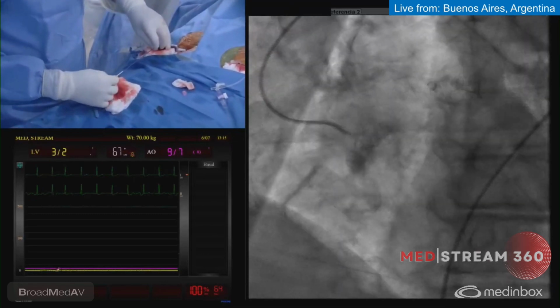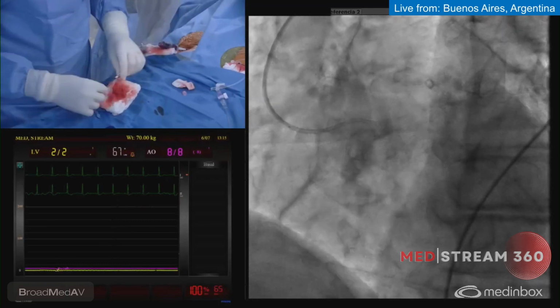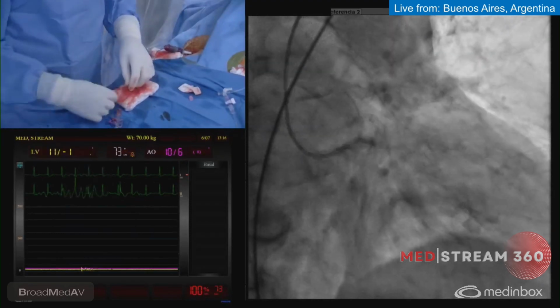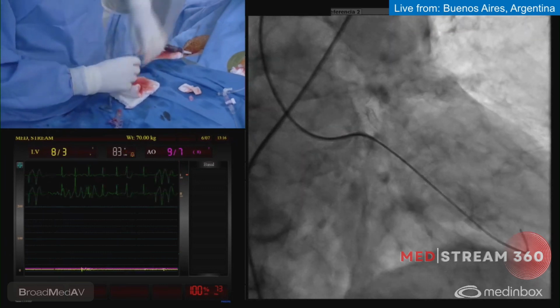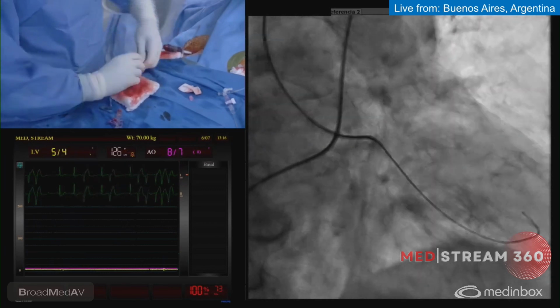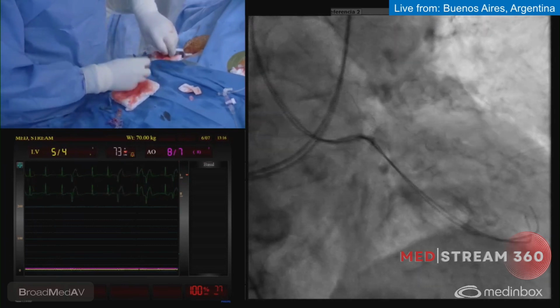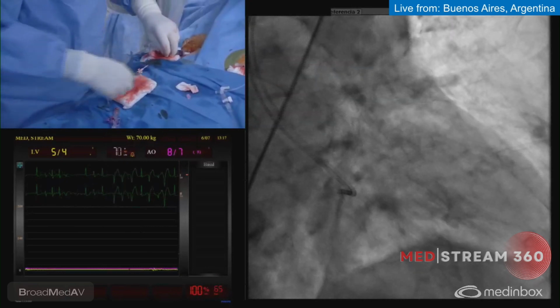Let's see. This is a very tight stenosis. Probably we need the Amplatz a little bit bigger. You see how tight is the stenosis? Let me test there. I don't know. Sapien 3 is supposed to be better for coronary protection because we don't have a too high crown. We have big cells in the proximal part of the valve. You see how difficult it is to cross? So probably we should use the Amplatz wire here. Show me the catheter. Now we are in a better position. Give me the Amplatz.